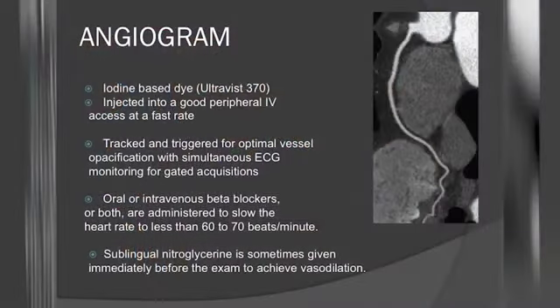The third component of the CCTA, so I spoke about what the coronaries are, the arteries which supply the heart, the CT scan, which is the computer tomography, a very advanced machine, and the third component is angiogram. So what is an angiogram? Angiogram refers to the visualization of an artery by putting contrast into it. So it's a generic term. It can be done in many different ways.